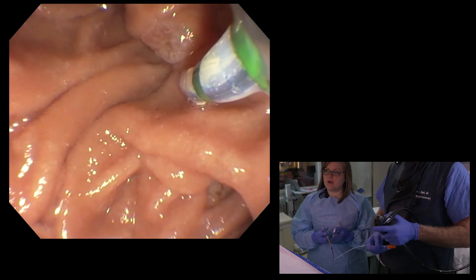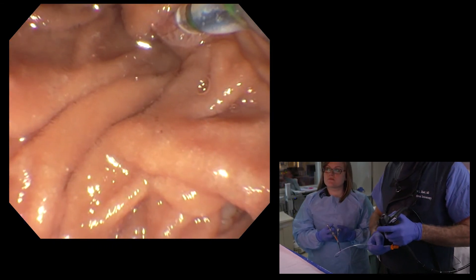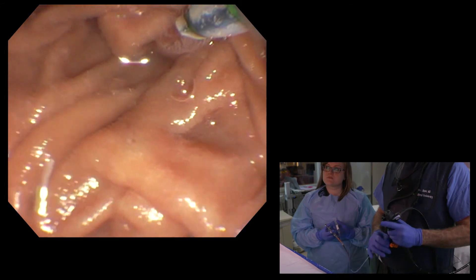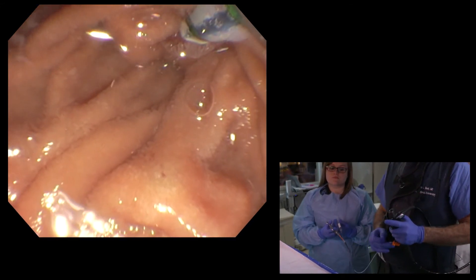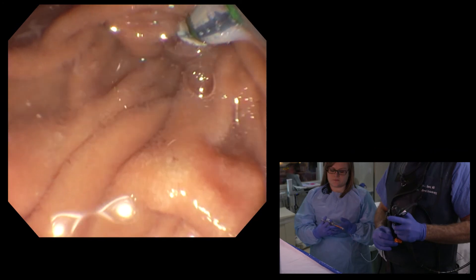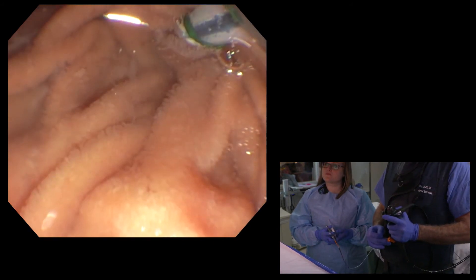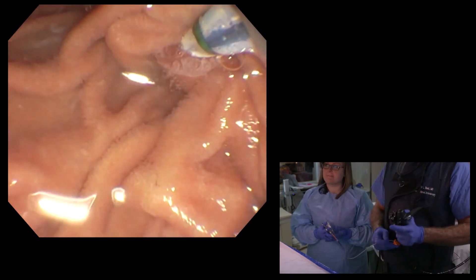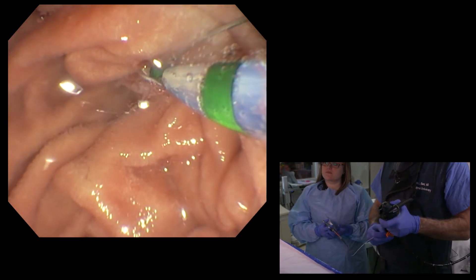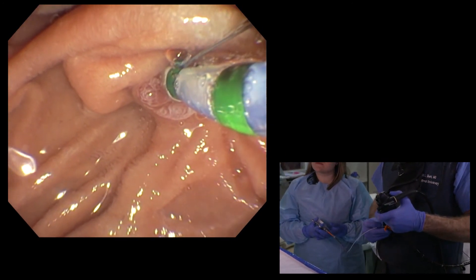One can see there's a little dimple in the middle. I'll want to go for the upper reaches of this papilla. Often with a bowed sphincter tome, if I can wiggle the tip of the catheter in, then I'll try the wire. So here I'm just wiggling a little bit. I'm gently advancing the wire, and I can see that the tissue is sort of pushing away, but the wire is not going up the duct — hard enough to know that I'm not yet in the duct. So I'll continue to try to deeply engage the papilla. And there you can see the white tip of that catheter just sunk in. So now I'll try the wire again.